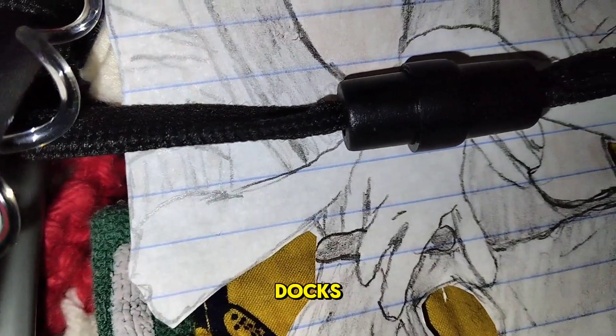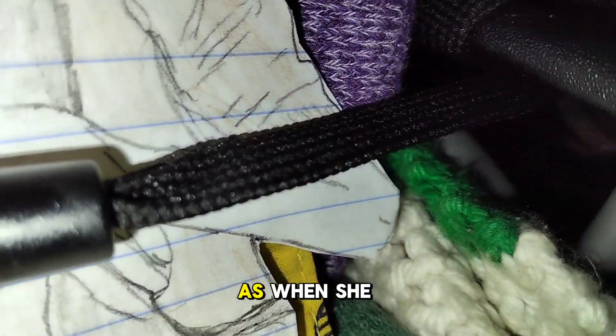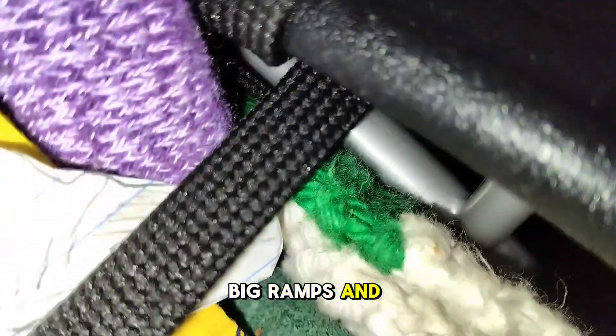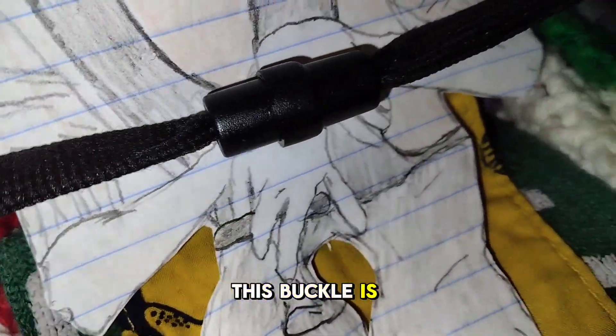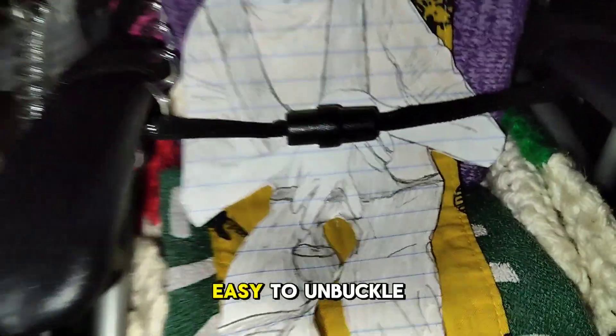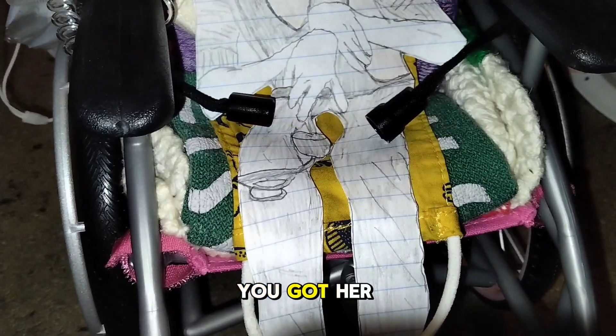Next up are Doc's chest straps. These help Doc stay in her chair — when she goes on big ramps and leans forward, it will help keep her in the chair. This buckle is also pretty easy to unbuckle; it just takes a little amount of strength and boom, you've got her unbuckled.